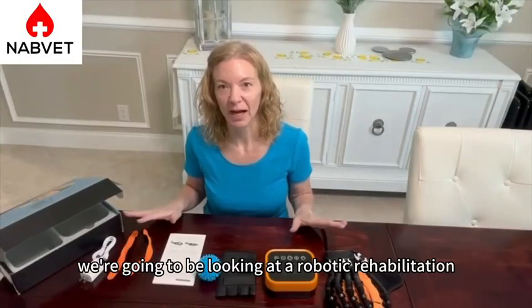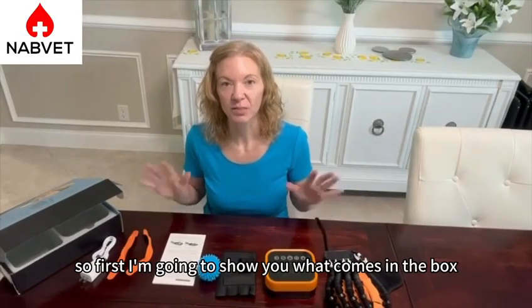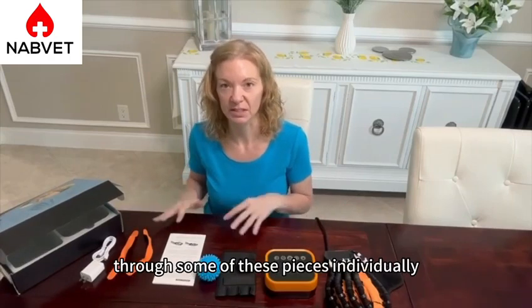Hi guys, today we're going to be looking at a robotic rehabilitation glove. First I'm going to show you what comes in the box and then we're going to take some time to go through some of these pieces individually.